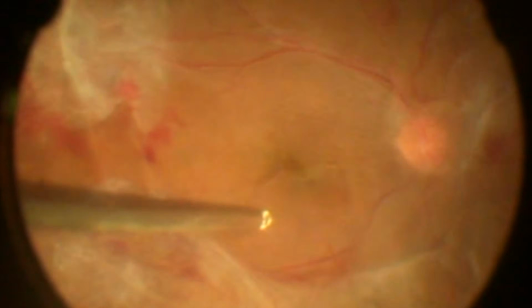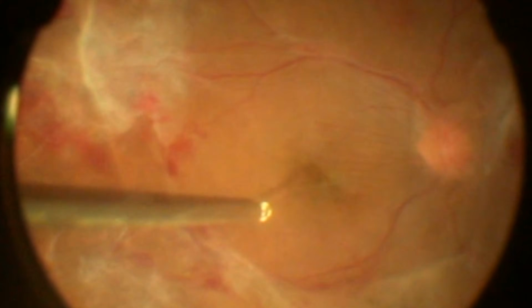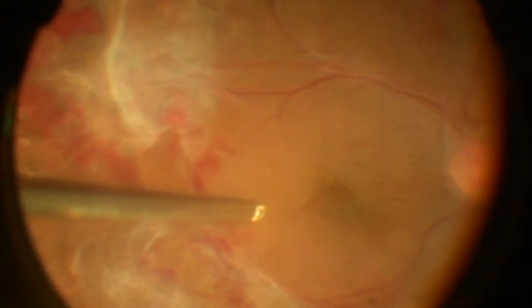At this point, the vitreous cutter is used to isolate the area of vitreomacular traction. By increasing the vitrectomy probe cutting rate and decreasing the vacuum, adequate control is achieved at this stage to avoid inadvertent traction on the macular region.